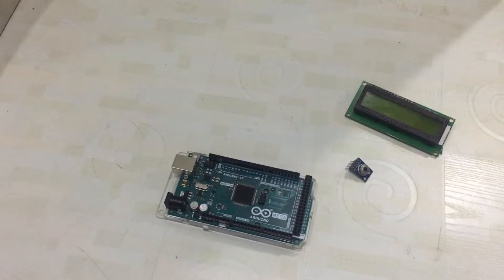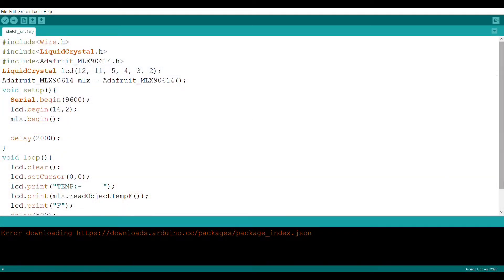Now the connections are complete. Let me show you the code and explain the programming. On screen you can see the code. First you have to include wire.h, then include the Adafruit MLX90614 library. You can search for it on Google or go to Tools in the Arduino IDE to download it.